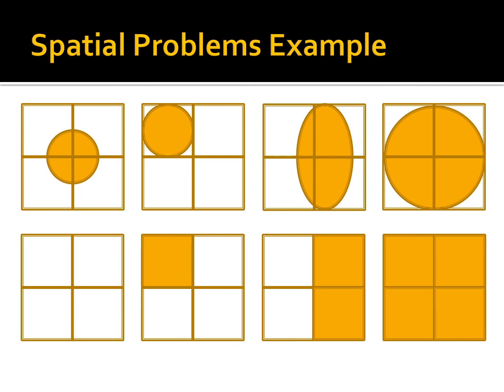In conventional radiography, objects 1 or 2 pixels in size are generally of no consequence. One example where small calcifications are important is in mammography. So the more pixels an object spans, the more definite it will appear in the radiologist's workstation. Increasing the number of pixels covered can be accomplished by making the pixels smaller.